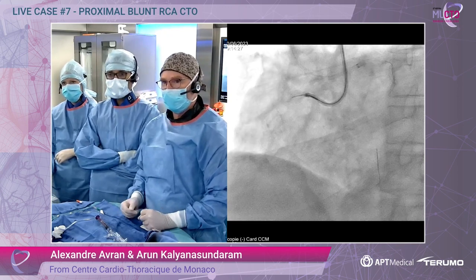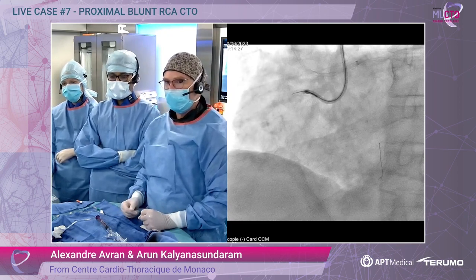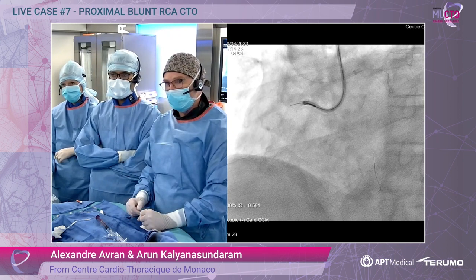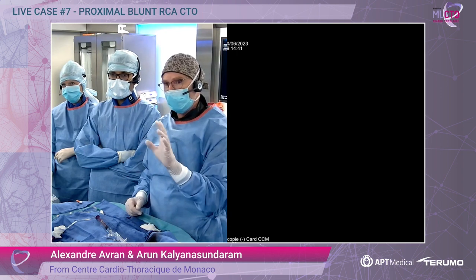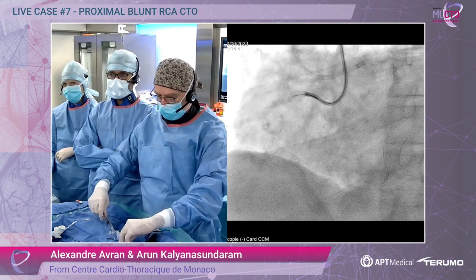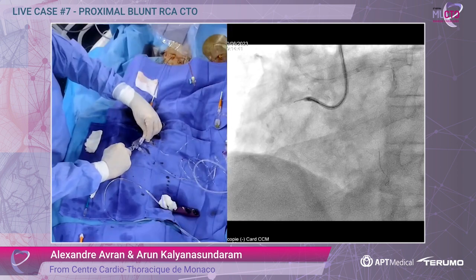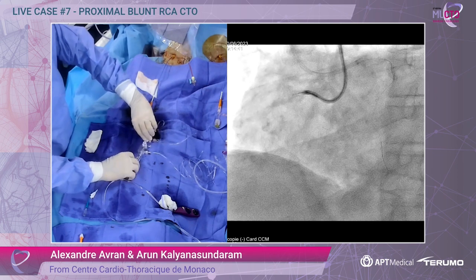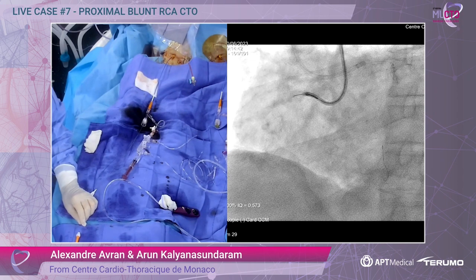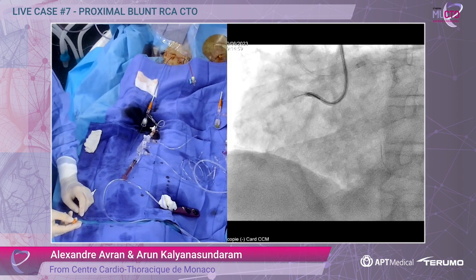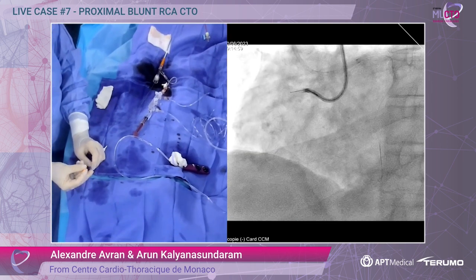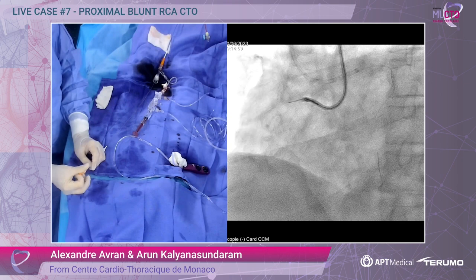We just advanced the ELONG microcatheter with a Gaia Third, and Arun worked with the Gaia and succeeded in puncturing the proximal cap. We are here now, just in the middle part. We will work with this Gaia — just check if the support is enough and then I will advance my microcatheter.